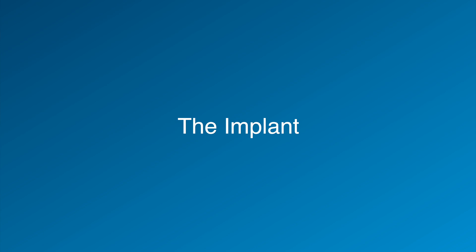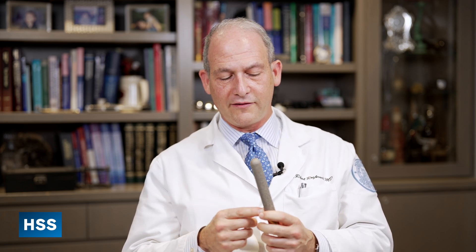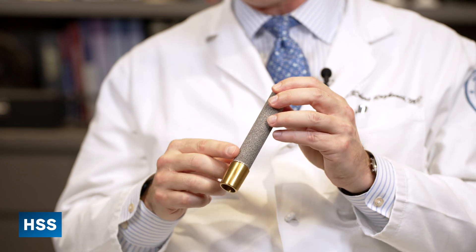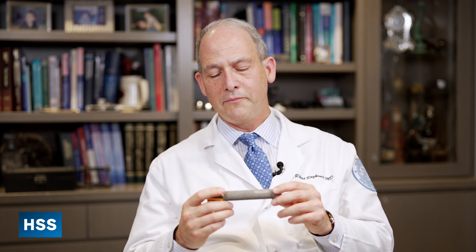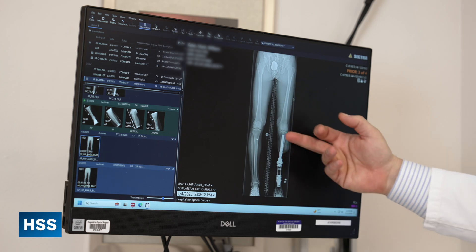People are often interested in what these implants actually look like, and here's a great example. A couple of important things: number one, it's made out of titanium, which is a metal that interacts really nicely with human bone — bone is attracted to titanium and has a tendency to grow into it. If you look carefully, the implant is textured — it's a porous-coated titanium implant — and the bone grows into all these millions of little nooks and crannies. Once osseointegration is complete, the bone is literally connected. Bone is hollow, like a pipe, and the implant is impacted into the bone in such a fashion that immediate stability is achieved.